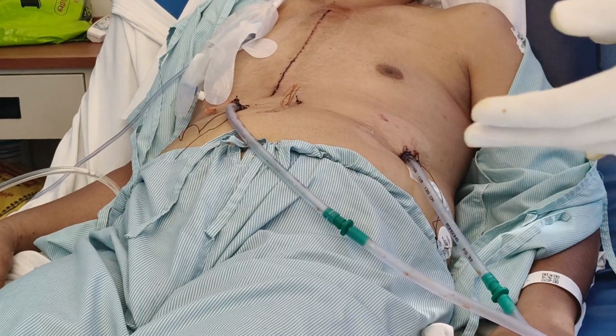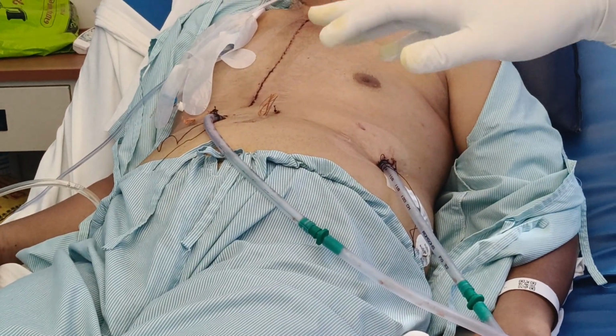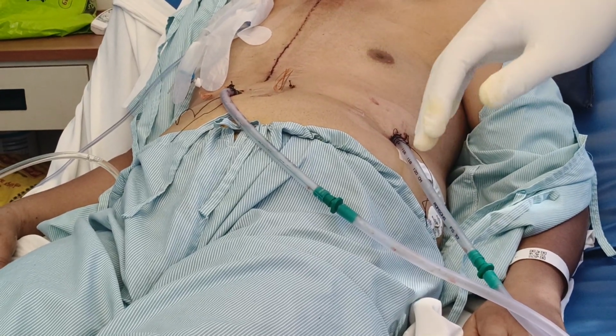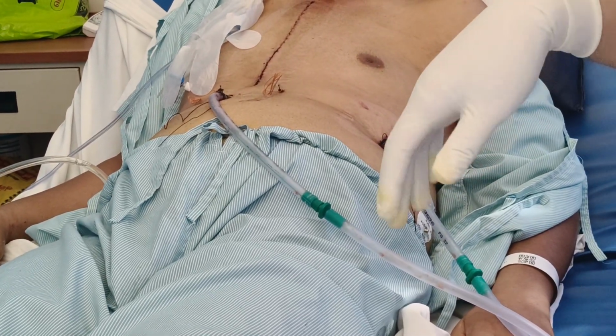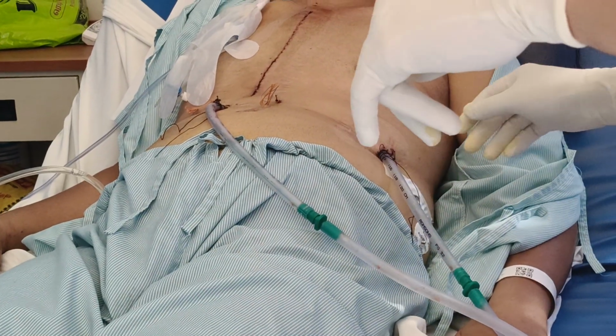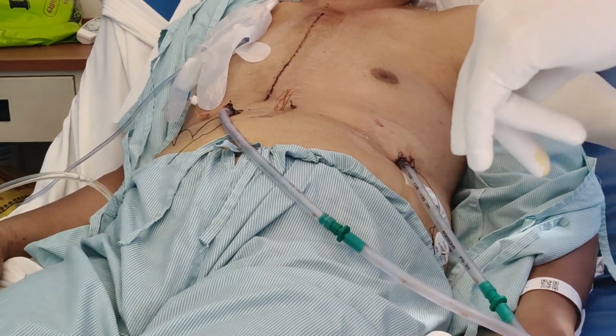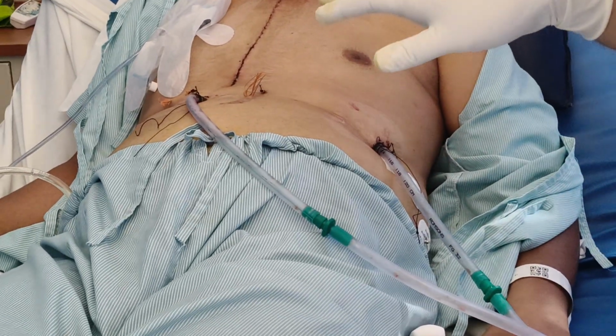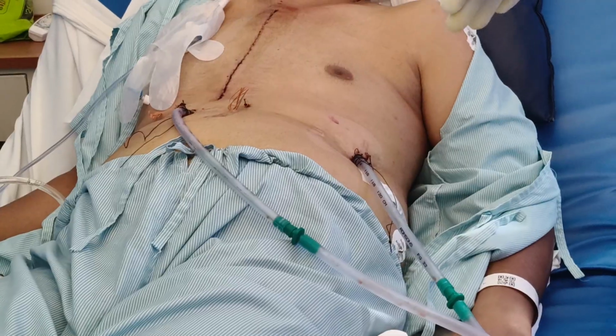Here there is no suction connected, but whenever you remove the drain, you should turn off the suction. If you are in an ICU, turn off the suction first. Otherwise, if it is a mediastinal drain, you will take the grafts out. Then you put the patient in a proper position. You remove the dressings. Then you start cleaning.